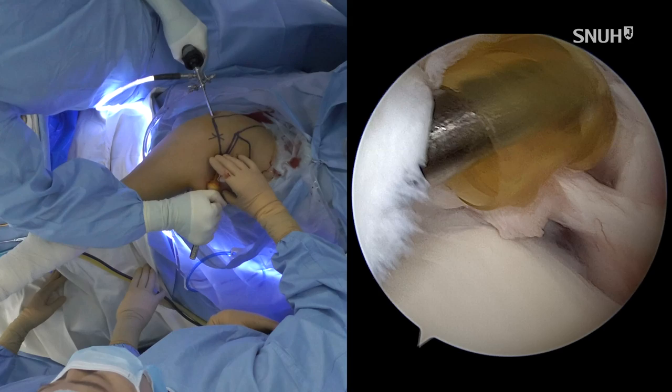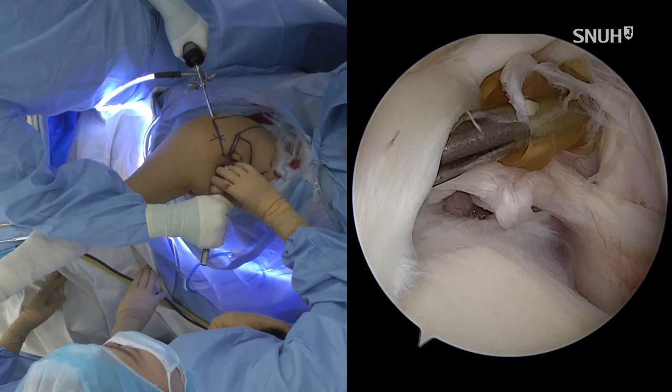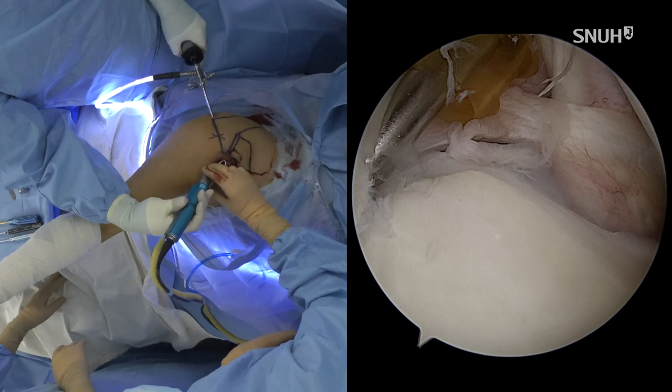We don't need to completely remove the cyst wall, but just break the cyst, and then usually that's enough. I have no cases of recurrence after decompression. Sometimes you can use a shaver under the SLAP, but you have to be careful.